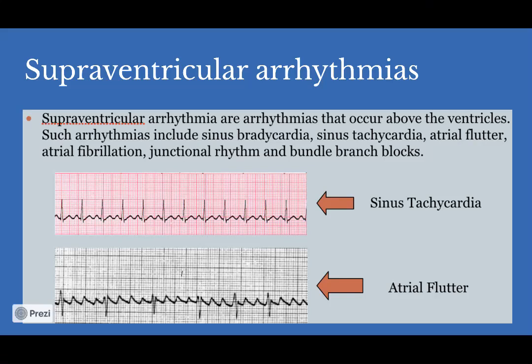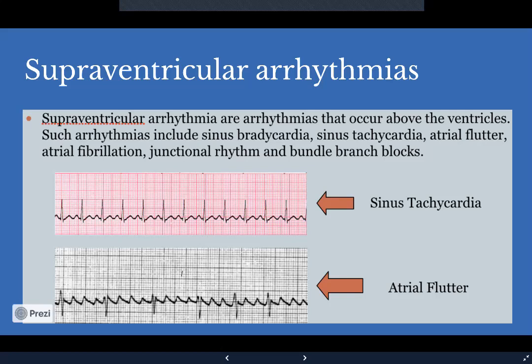is 120. So I'm sure this is probably a 50 millimeters per second. So we could probably say that this is probably not sinus tachycardia right now for us, but if we did 50 millimeters per second, it might be sinus tachycardia.